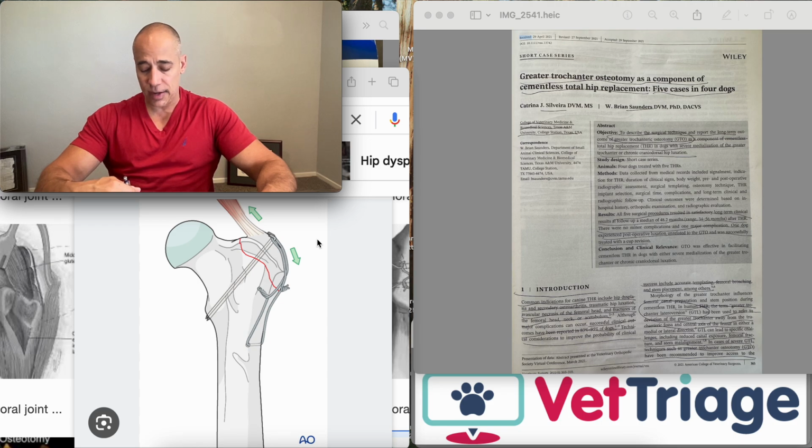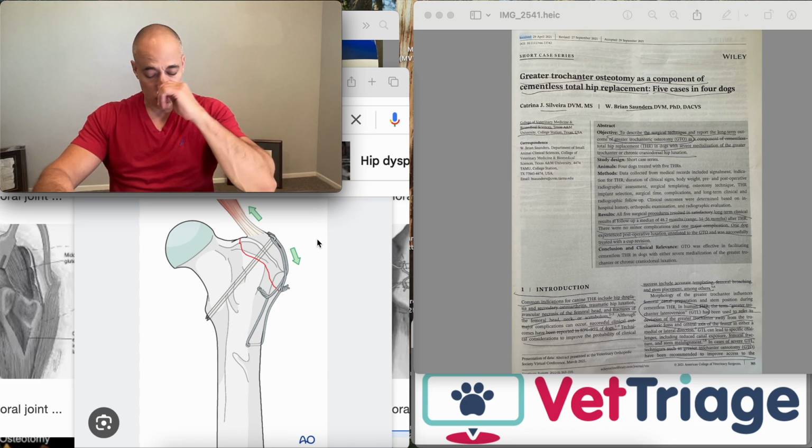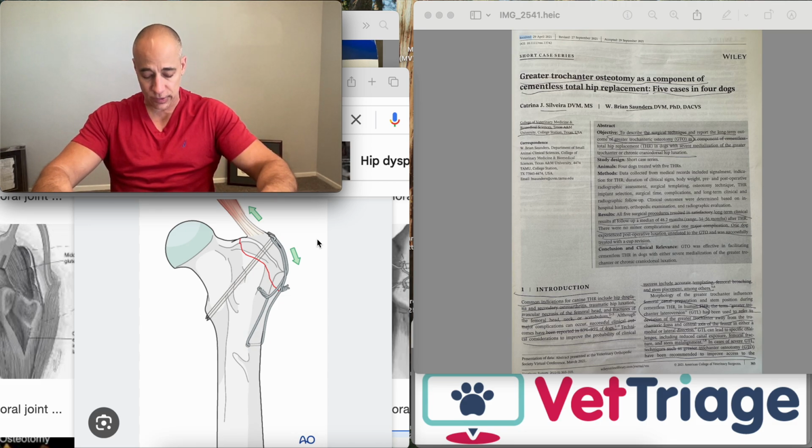While the osteotomy is not necessary for many cases, it might be considered in cases of craniodorsally fixed femoral heads and/or severely medialized trochanters. Complications related to concurrent osteotomy and hip replacement occur in humans in up to 38% of cases. Most common is non-union. The reason for that is this greater trochanter is very solid bone. Solid bone has little to no bone marrow. Bone marrow is where the healing occurs.